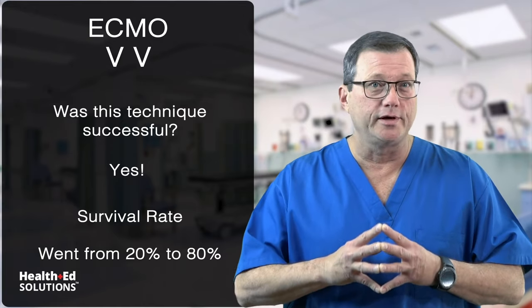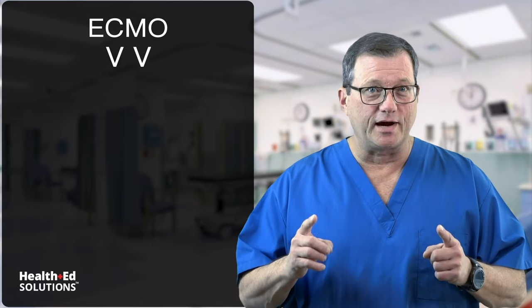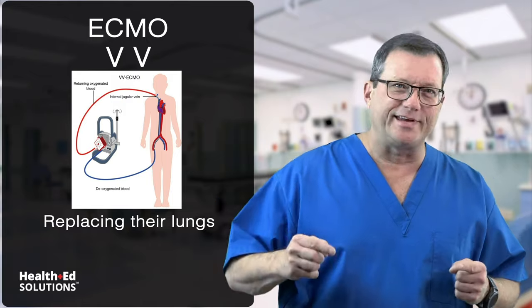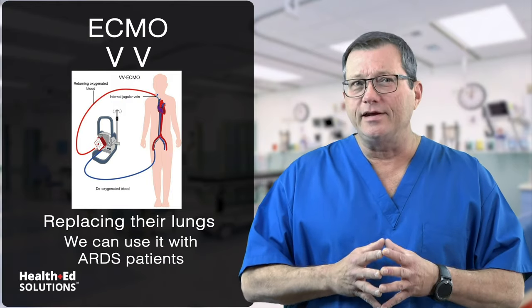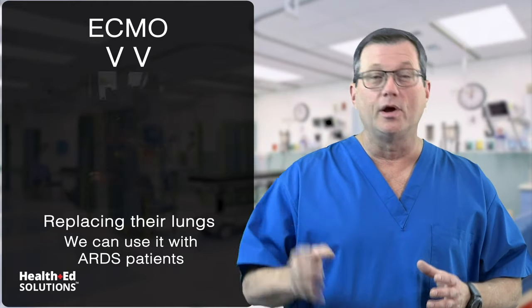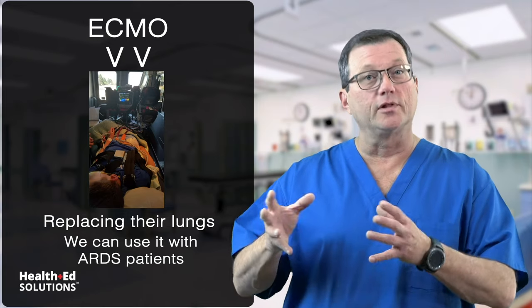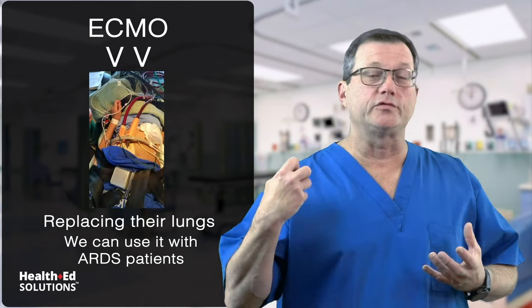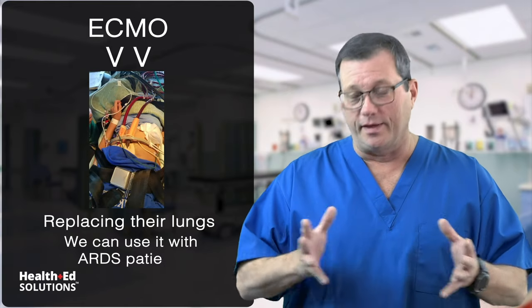Was this technique successful? Yes — survival went from 20% almost up to 80%. So ECMO was a wonderful, viable option for brand new neonates with poor lung function. VV ECMO is just replacing the lungs. Fast forward to today, we can use VV ECMO for ARDS patients — anytime you have respiratory failure where we think we can fix the underlying pulmonary issue, we can put the patient on ECMO, give the lungs a break, let the lungs heal, wean them off the ECMO, reintroduce the patient's own native pulmonary function, and save that patient.